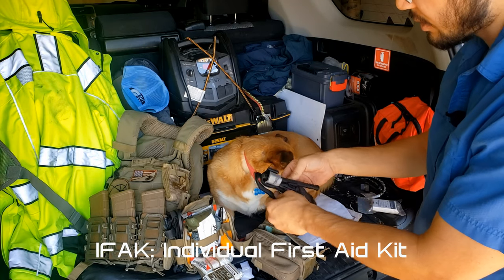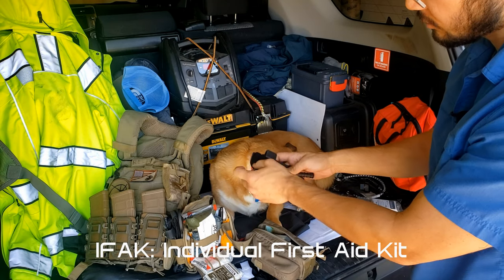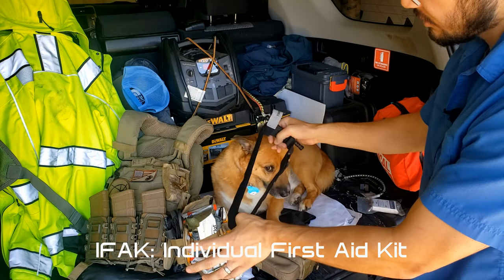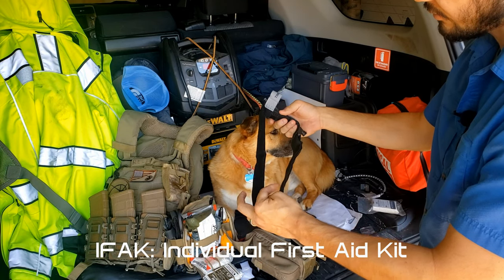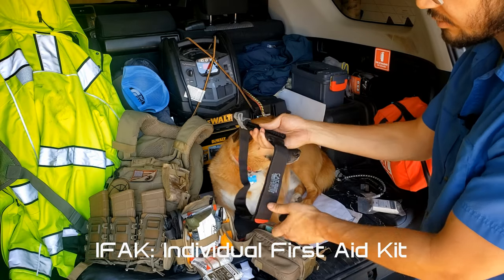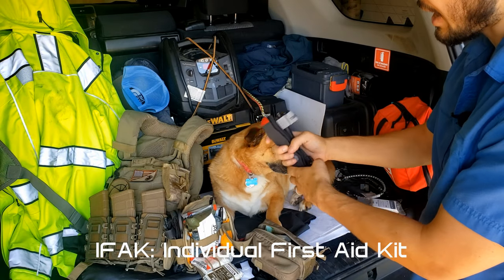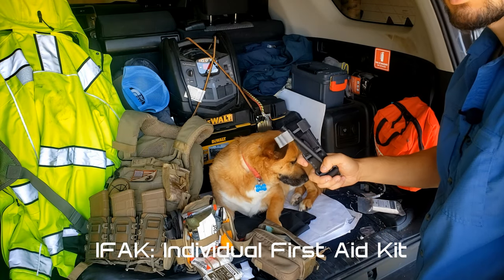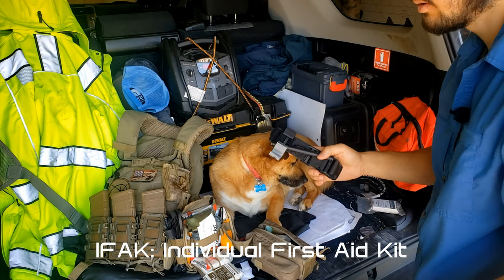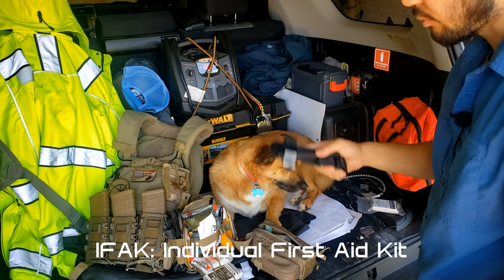But you'll notice mine has this strap open, so the windlass is accessible. This is nice and open, so it's big enough that I can fit my limb through there, and all I've got to do is slip it over and yank this to tighten it. We'll do some videos at some point about how to actually use these. But they're readily accessible, right? If I'm pulling this, my life is on the line. I'm not going to risk it by going cheap, and I'm not going to risk it by not properly staging this.